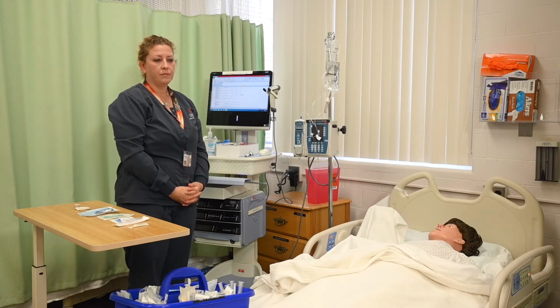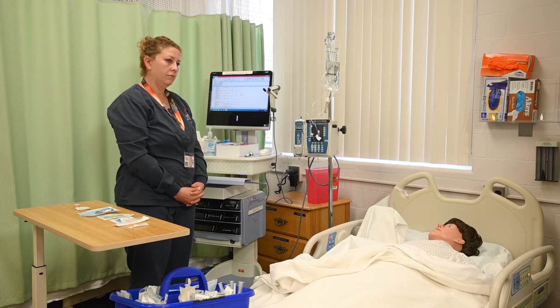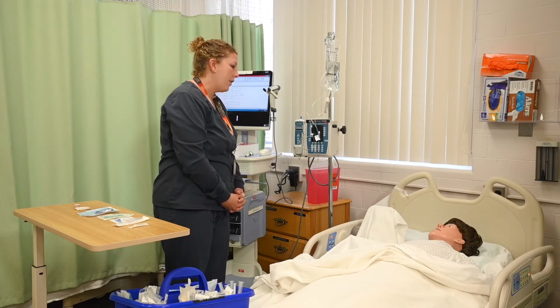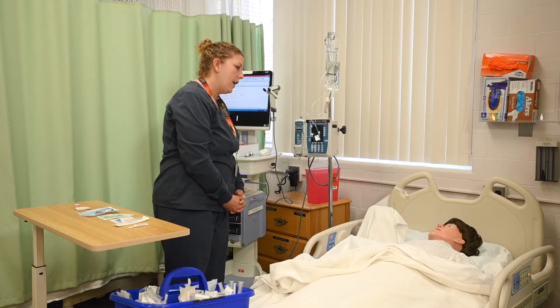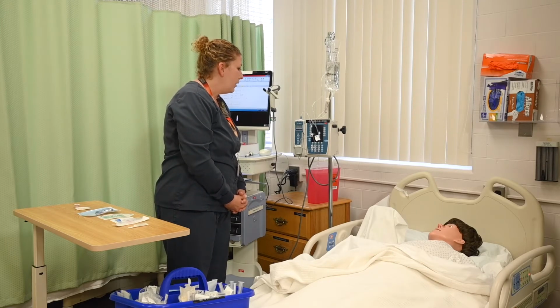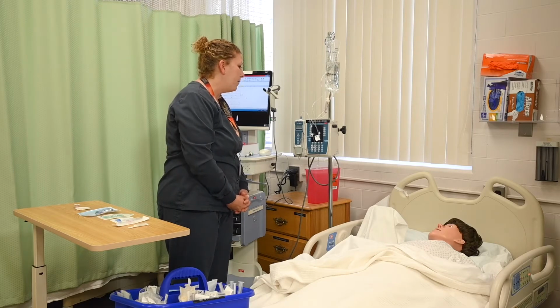Okay. Explain to the patient the reason for the infusion, the solution ordered, the procedure initiating the IV, and signs and symptoms of complications. So Ivy, today I'm going to be putting an IV catheter in your arm. Have you had an IV catheter before? Good. So I'm going to insert a needle and a catheter into your arm, then the needle will be withdrawn and the catheter will remain in place.